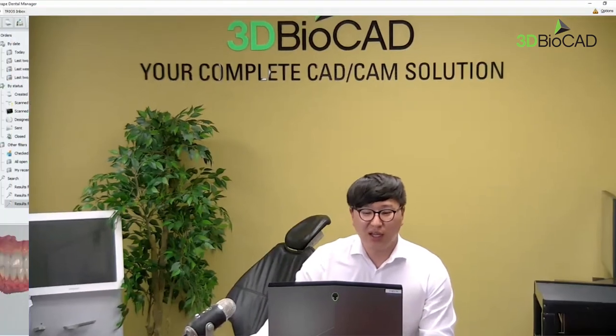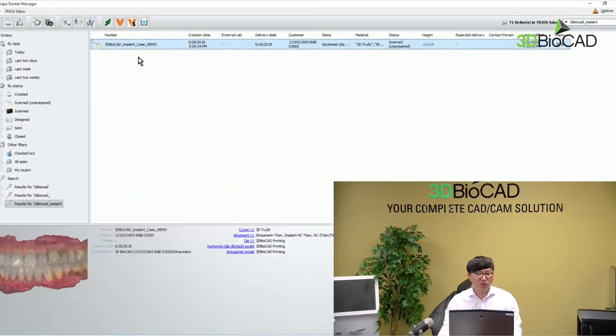Today we're going to go through the implant case, which has come from the TRIOS file. So first, in the dental system, once we got the scan file from the TRIOS, we should have it in the TRIOS inbox mostly, and then after accepting, the case comes into orders. The first thing we have to do is check the bottom left side here.